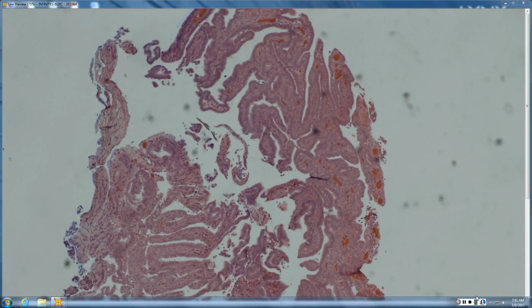HPAP. So certainly looks like an apocrine maze, and this one is an HPAP. What if I told you this pretty much identical looking lesion came from a nipple? Erosive adenomatosis, intraductal papilloma, is basically like an HPAP within the mammary duct in the nipple.